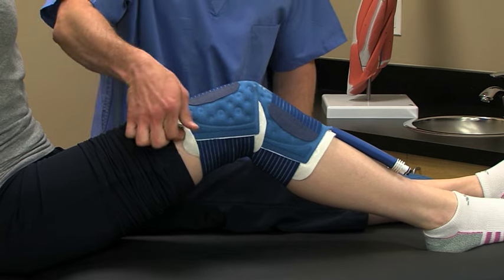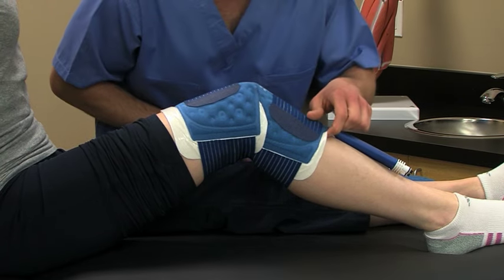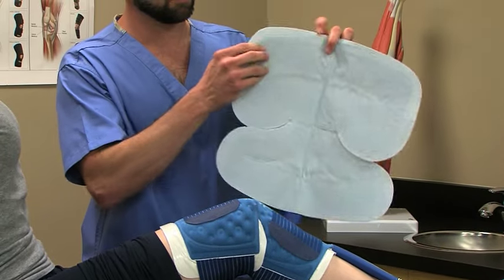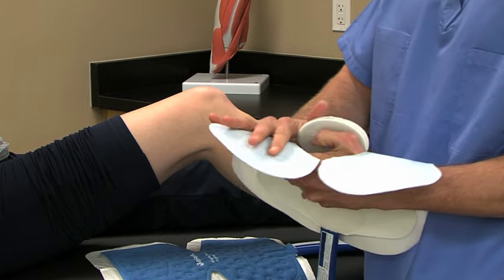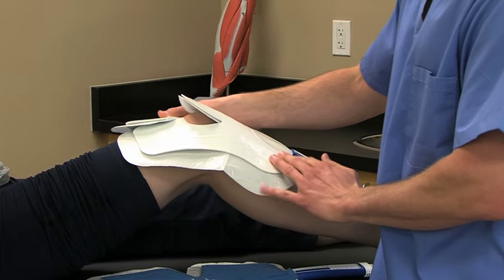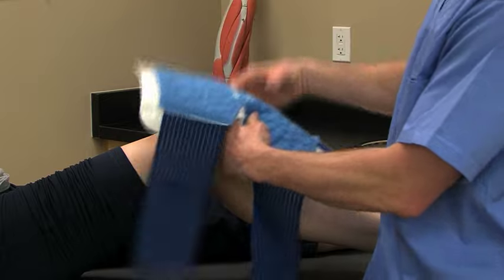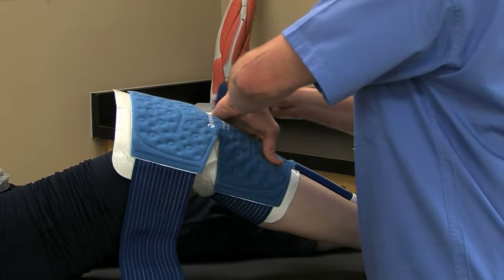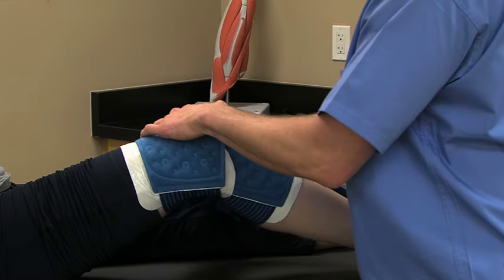Don't let any part of the pad touch the skin directly. If the patient is wearing a sterile dressing that doesn't completely cover the skin under the pad, use an additional barrier. With the insulation barrier in place, if using the PolarPad, apply with a smooth side up. When using a wrap-on pad, apply with a blue side up. Use the elastic straps to hold the pad in place. For information on how to properly apply a specific pad, watch the pad module that details your specific pad.